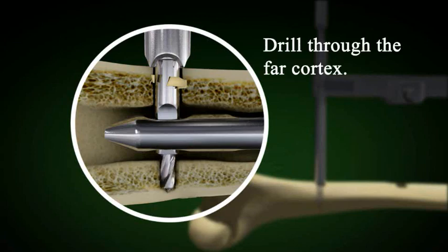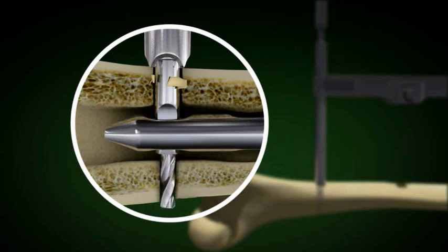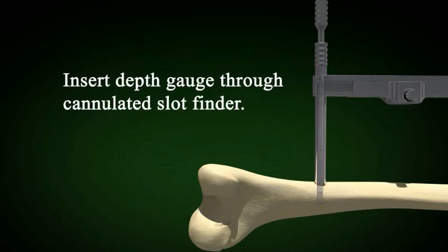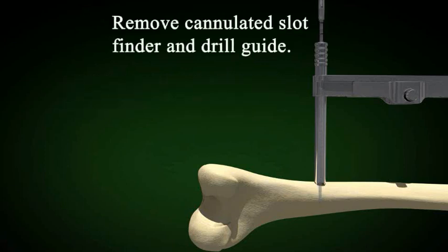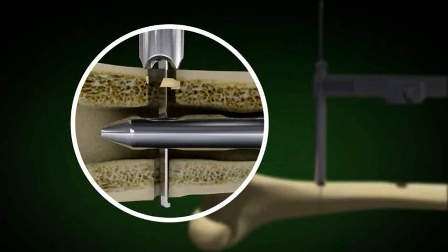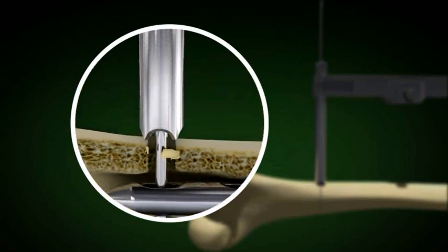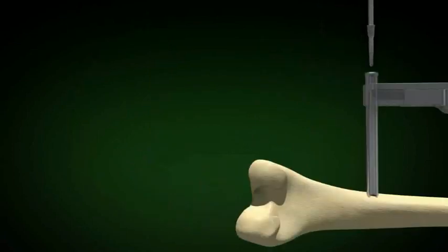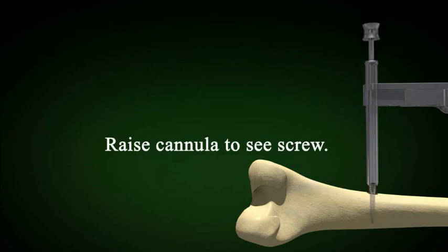Once the cannulated slot finder is inserted, drill the hole in the far cortex. Remove the drill bit and replace it with the depth gauge. The depth gauge is used to mark the hole. Remove the cannulated slot finder and the small drill guide to accurately measure for the screw — measure on two sides of the hole. Add five millimeters of screw length to the measurement on the cannula; this extra length provides stability and allows for screw removal if needed.